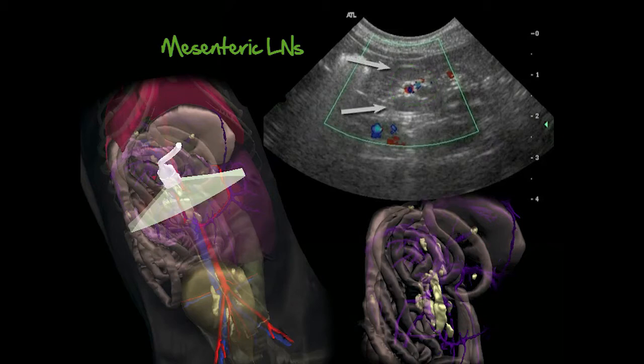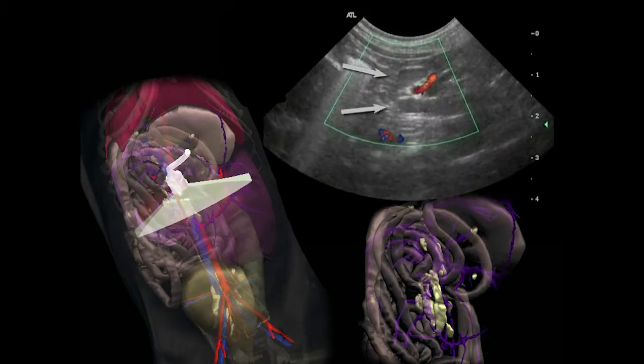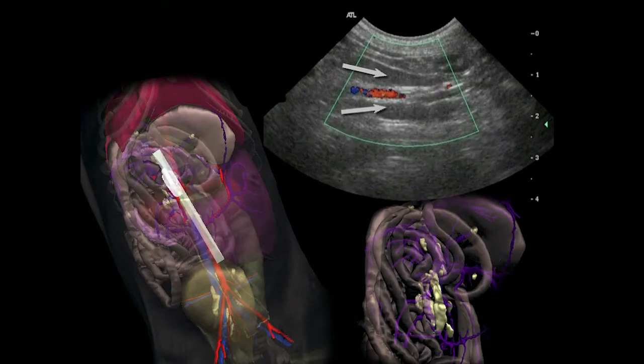The nodes have an echogenicity and echotexture that are similar to the spleen. These nodes present a fine-grained texture, which contrasts with the surrounding fat that is coarser in echotexture, even though their echogenicity is usually similar. In the longitudinal plane, we can recognize their fusiform shape, even though one extremity is often rounded. The capsule is strongly echogenic, thin, smooth, and well-defined.